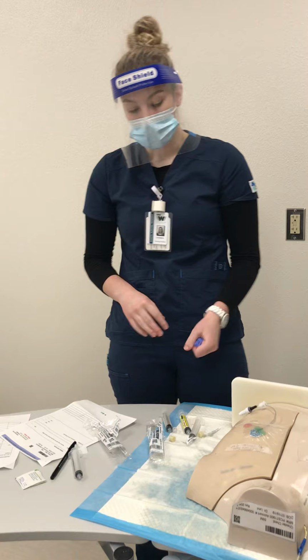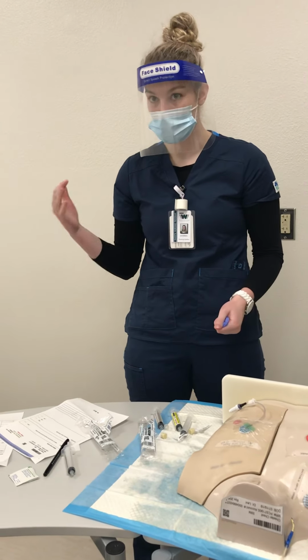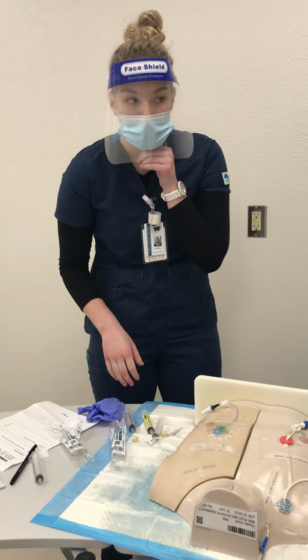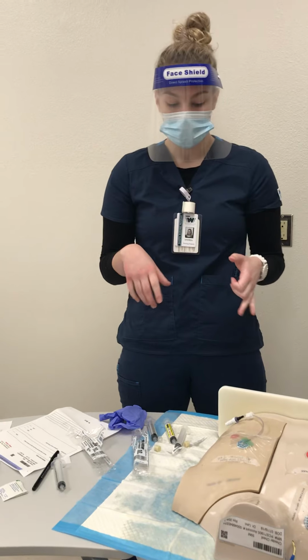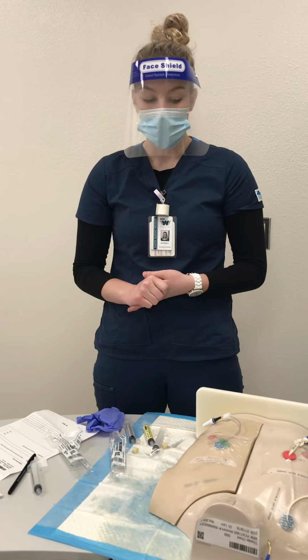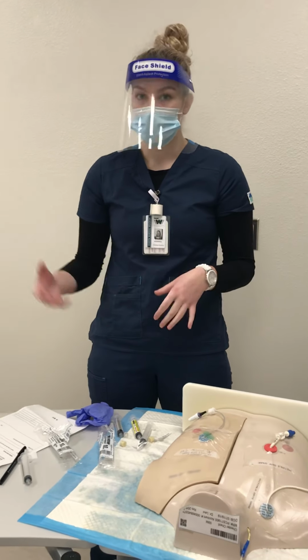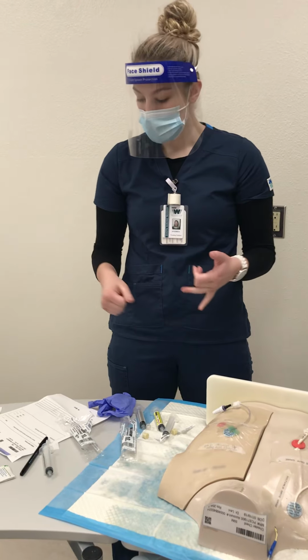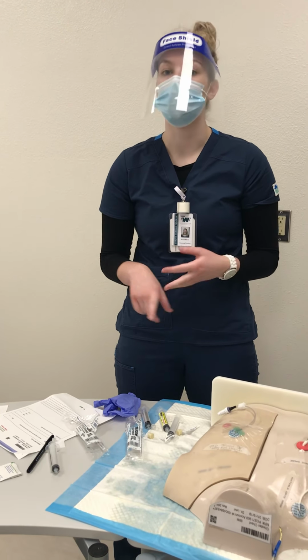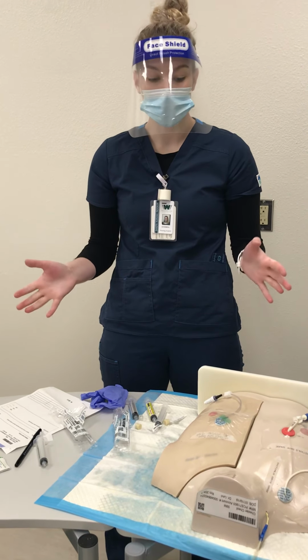And then once that's completed, make sure my patient doesn't need anything, all the safety checks are completed, and then I'm going to go back and document. First I'm going to document my blood draw, and then I'm going to document my dressing change, what the site looked like before I changed it, the measurement of the tubing that I took, as well as the time that I changed it, and as well the medication that I verified with another nurse, the time I administered it, that I saline flushed it, medication, saline flushed it, and then heparin flushed it after that. So once all my documentation is completed, then the skill is completed as well.